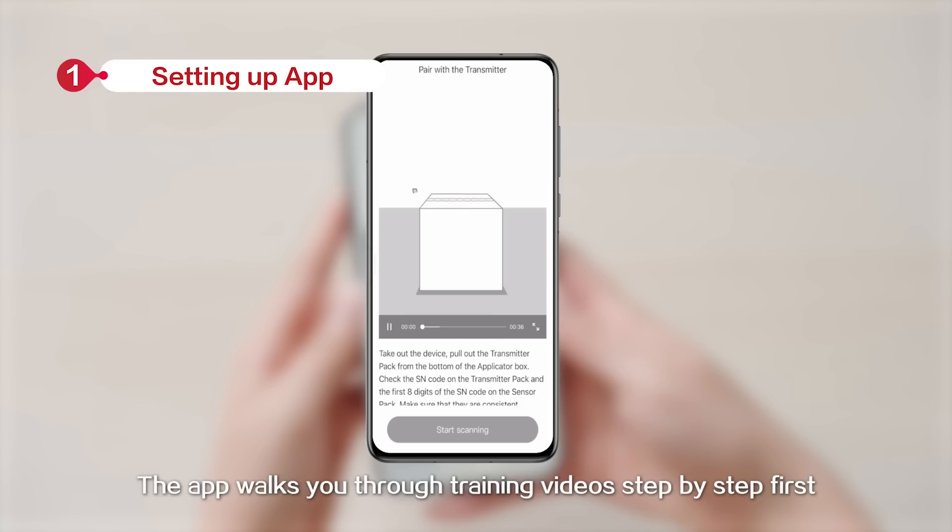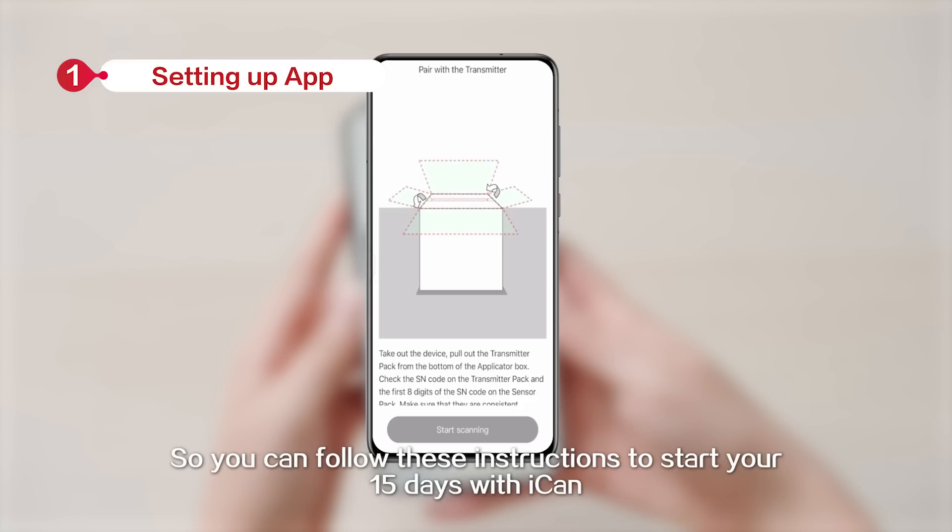Once logged in, the app walks you through training videos step by step, so you can follow these instructions to start your 15 days with ICANN.